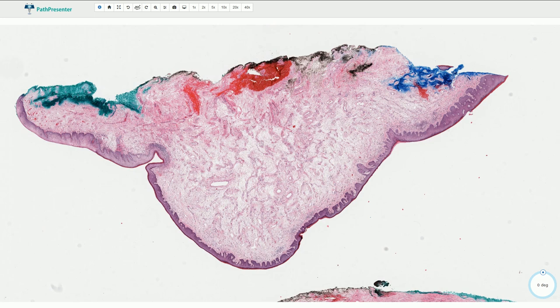It is usually a large lesion. It is slow growing but it is associated with a locally destructive and infiltrative type of growth.